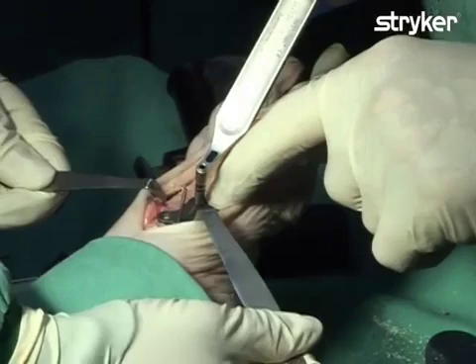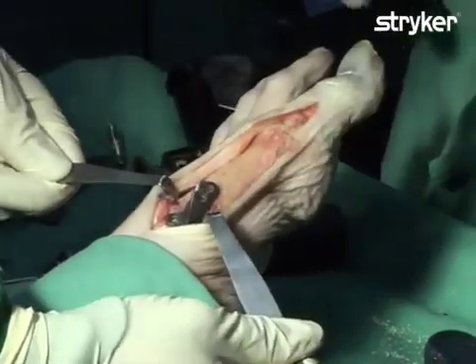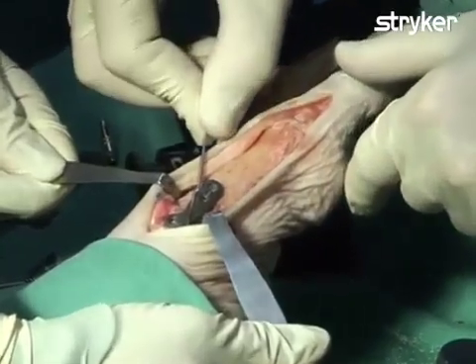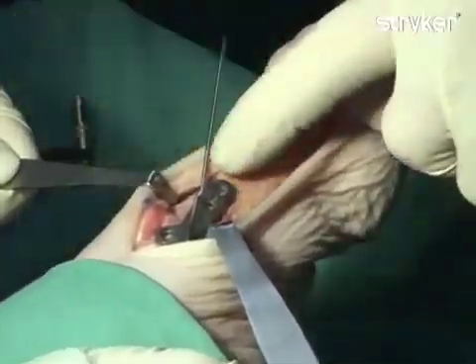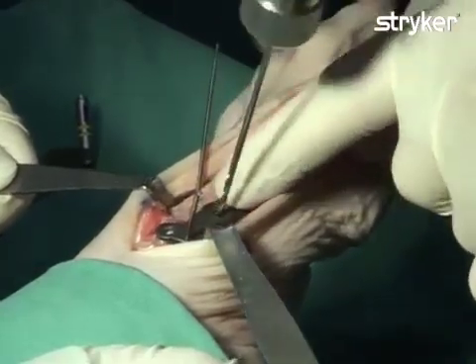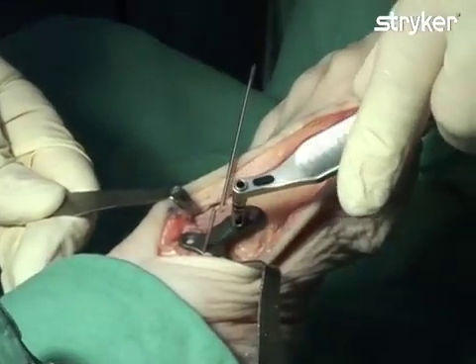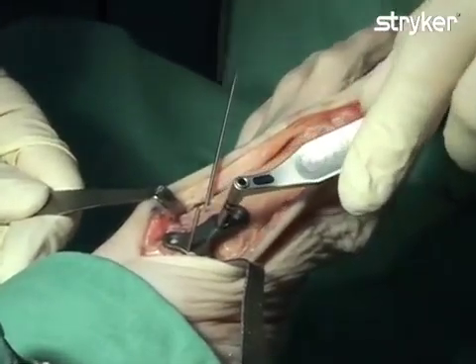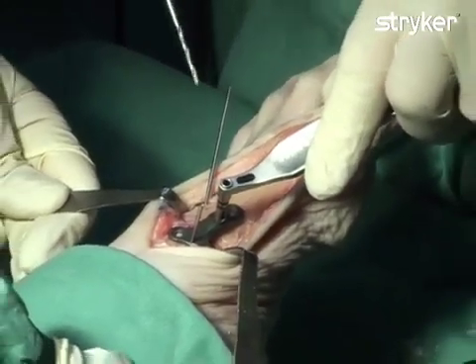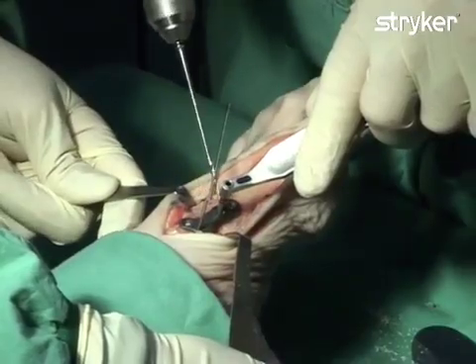Importantly, a main advantage of the poly-axial locking technology found within Variax Foot plates is that if a pre-existing independent lag screw is already implanted, the screw hole can be easily redirected at an angle designed to avoid the pre-implanted lag screw. For example, the drill can be directed more plantar, more dorsal, more proximal, or more distal. Therefore, screw conflict can be avoided between a lag screw and a locking screw.